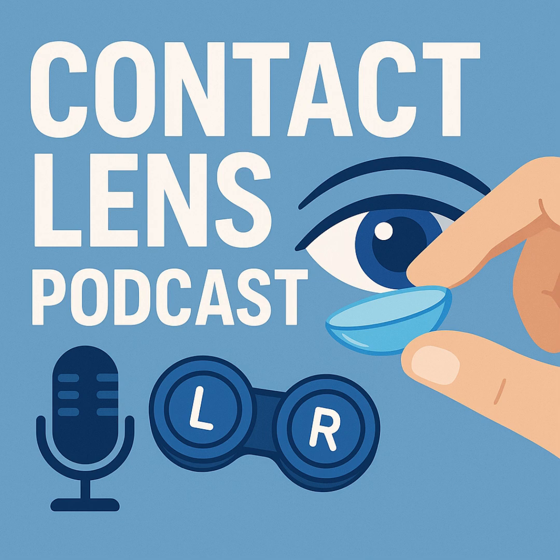Okay, so what if your eye isn't perfectly round? What about astigmatism? Right, that takes us to toric lenses. Now, this is where things get more specific. Astigmatism means your cornea, the front part of your eye, is shaped more like a football than a basketball. Uneven curves. Exactly. So light bends differently depending on the direction. A toric lens isn't just a simple curve. It has different powers built into different meridians to correct that.